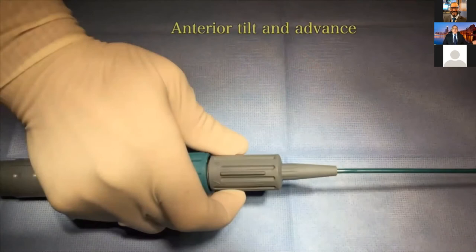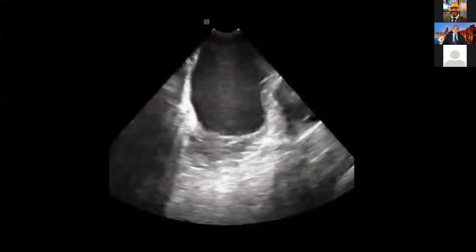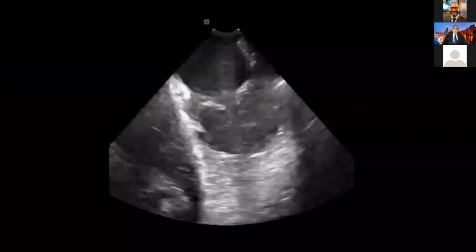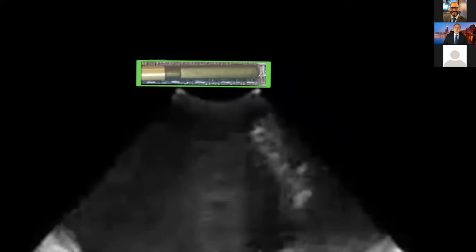Anterior tilt is one of the most common maneuvers you have to use. Here you can appreciate going from the right atrium, through the tricuspid valve, into the right ventricle. Pay attention to those two dots — those two dots are actually the tip of the ICE catheter. The distal part is one dot; the other dot is the proximal part of the transducer. So if I rotate it and look down, the ray is coming down and those two dots are the tip of the ICE catheter. By looking at those two dots, you can always know where your ICE catheter is.